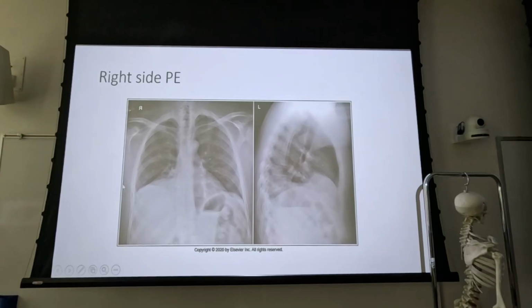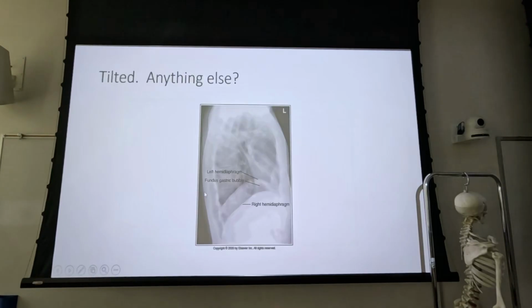But with that pleural effusion there, naturally what appears to be the diaphragm over here is going to be elevated. That's not a tilt issue. Again, we don't really have any rotation present. If you look at the vertebra, they're still blocky looking. The patient's well positioned. It's just that they've got a pretty good sized pleural effusion. So we're going to say we've got tilt in this one. Which way are we tilted? There's a right hemidiaphragm, left hemidiaphragm. Which way are we going? Going away, exactly. Plus we've got a little bit of rotation there as well.